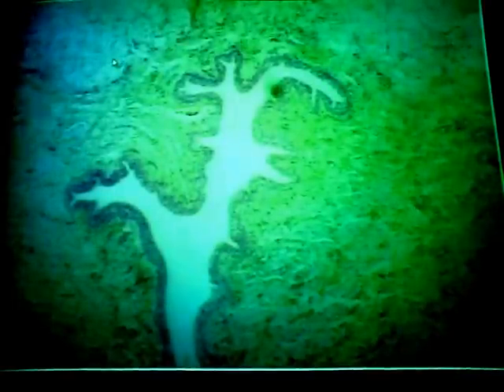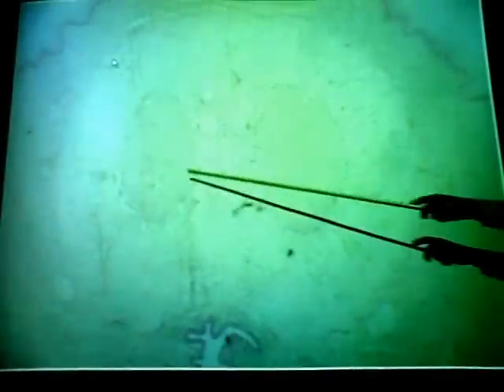Now there are two additional columns that are dorsal to the urethra. Here they're not very well developed because this is an immature penis. But to me they sort of look like little bean-shaped structures, kind of mirror images of one another. Okay, here and here. Almost like a little lima bean. At a little lower magnification, you see right here and here.